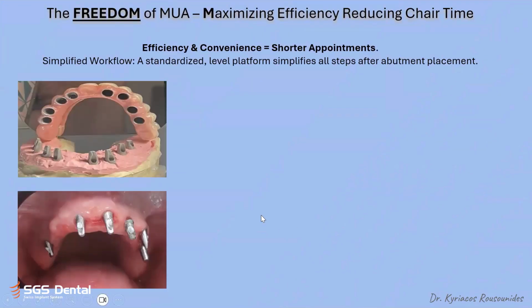At the same time, imagine how much time you need to find the right position for each of these abutments to insert them under local anesthesia, because they are pressing in the gums. And if one of them goes wrong, then the whole procedure doesn't sit. If you sit for these 8 abutments, you have 6 positions each. So if one doesn't sit very well, or in the right angulation, then you have to do the whole work from the beginning, and that takes time on the chair.